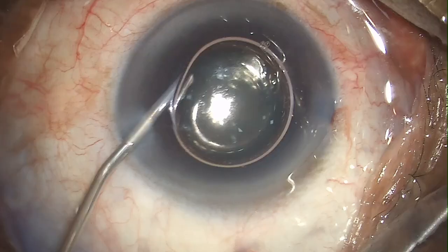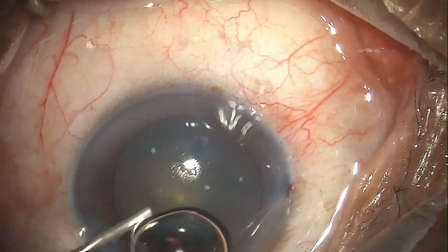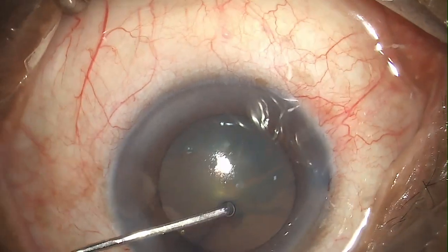Here I'm using Trypan blue to stain the anterior capsule. With a viscoelastic device I'm removing the air bubble, but I'm not able to completely remove the air bubble here, so I have to use another instrument to get it out — I'm using a hydro cannula here.